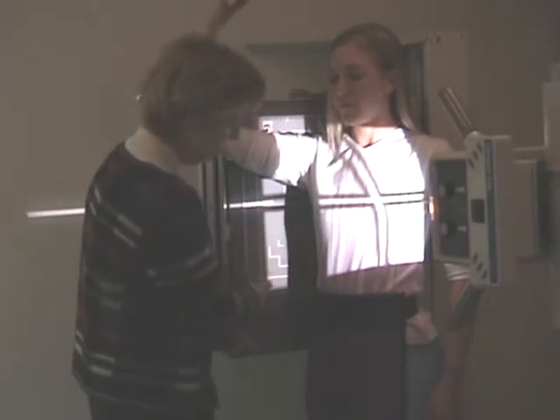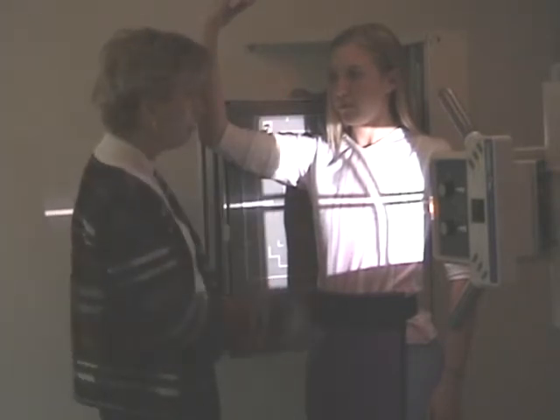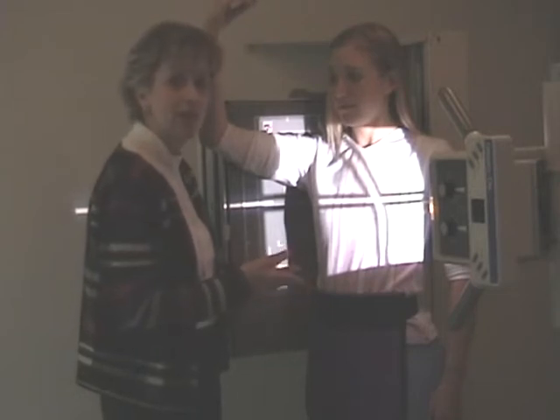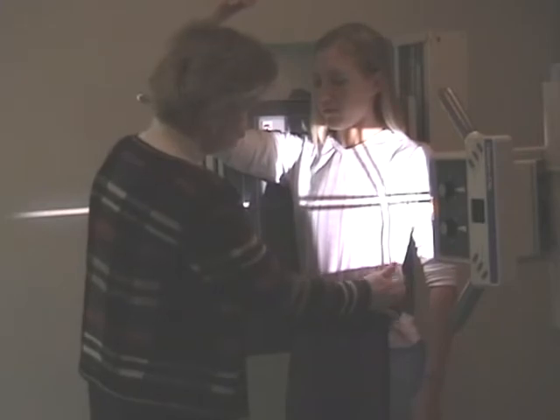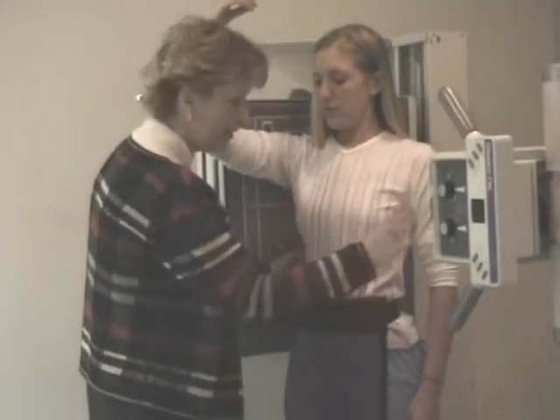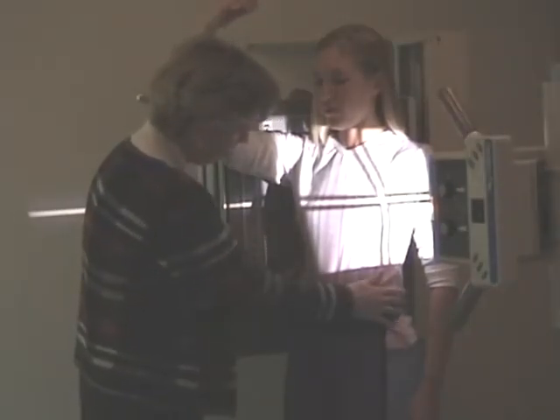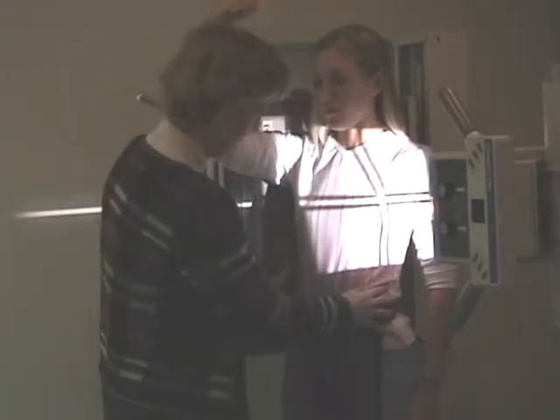And now, see how much light I have on the tabletop here? I know I've got to change my side-to-side reference point. I don't have to change the vertical because she didn't grow in between these two positions. She stayed the same height. But this way I've got to have her step towards me because I want as much of the rib cage on there as I can. And here's her clothes. This is breast tissue that I'm clipping here. And I just want a baby amount of light on the tabletop. And I look at this crosshair coming down, and I'm satisfied with that positioning for the oblique.